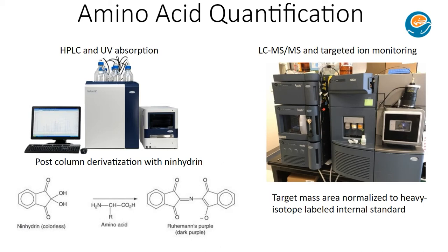So this is why this particular instrumentation is primarily used in reference laboratories, where they may have entire teams of development scientists able to provide support for this instrumentation. And also they have the sample volumes to justify the initial setup cost and development. The mass specs are quite a bit more expensive to purchase than an HPLC with a UV system. So those are our two methodologies. They each have their limitations and their strengths.